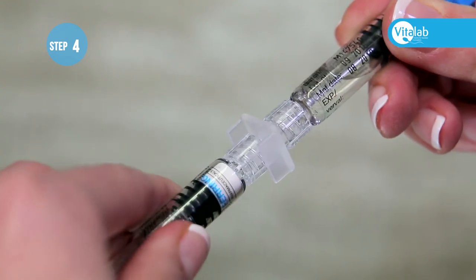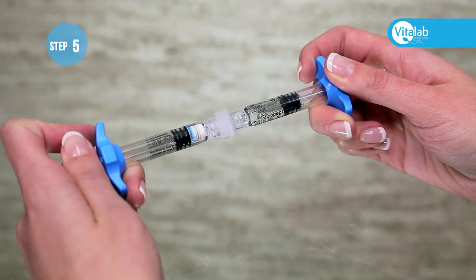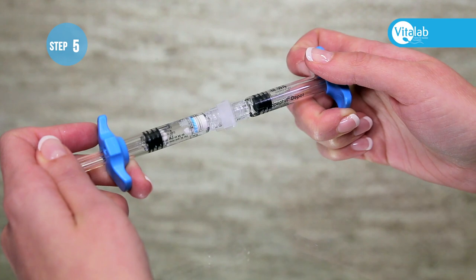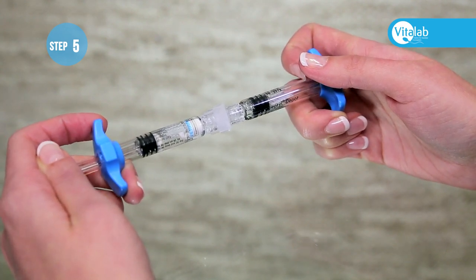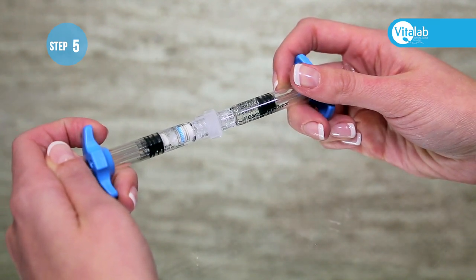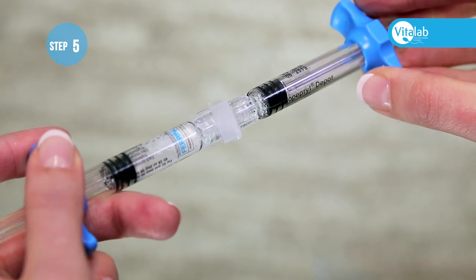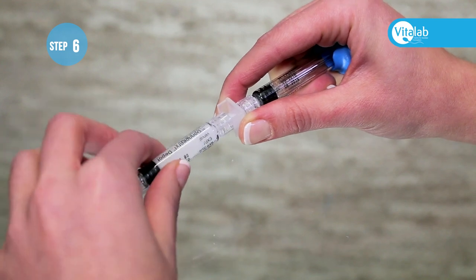With both syringes now in your hands, screw the powder syringe onto the other side of the connector securely. Push the liquid into the powder syringe, then slowly push the mixture backwards and forwards from one syringe to the other. It will not all mix instantly — you will need to do this about 10 times gently until all the powder is mixed and you have a white milky solution. You'll see bubbles in the mixture. With all the mixture in one syringe, remove that syringe from the connector.